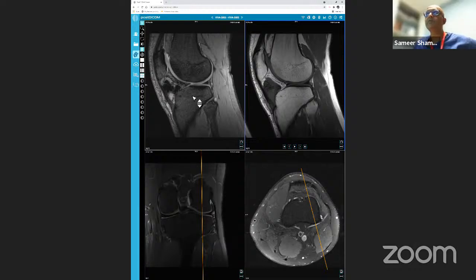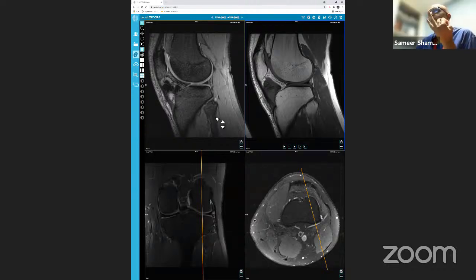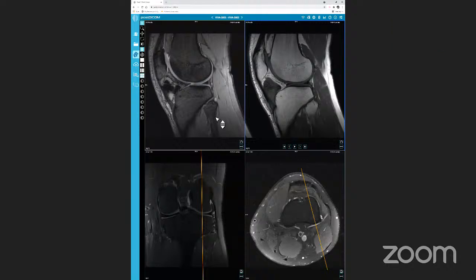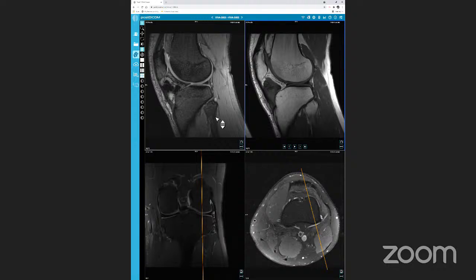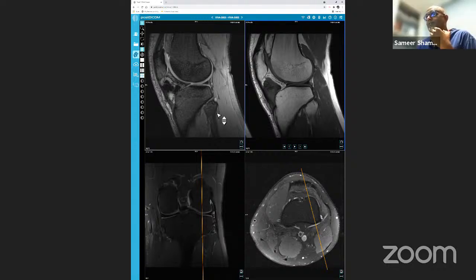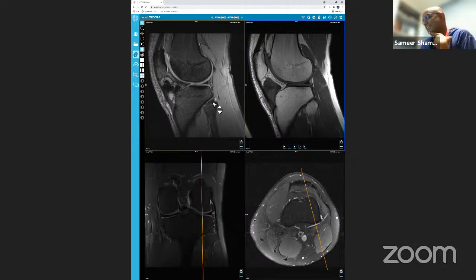So what all things can bloom on the gradient echo sequence? So calcium could as well. Yeah, calcium. Not as much as blood. What else? I need at least 4 of them. Metal. Metal, excellent, good. So metal, calcium, blood, and... Contrast? Not contrast, you are very close. Metal, you said foreign body? Foreign body? Yeah. Gas pockets? Gas, okay. So that's especially in knees. So when people fall and if you get any gas pockets inside, they can also bloom.